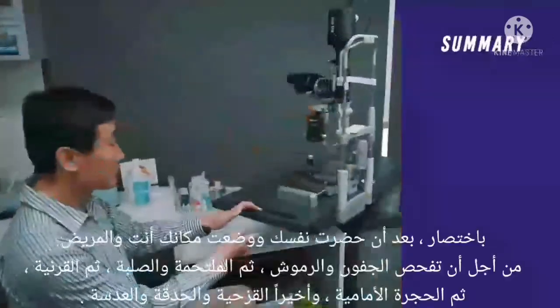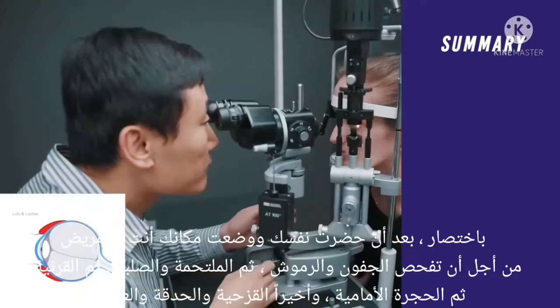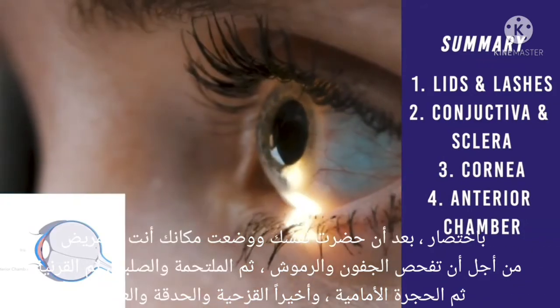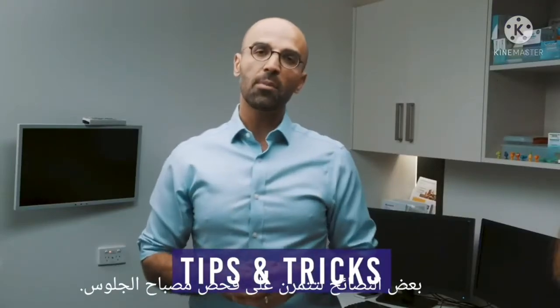So in summary, after you've prepared and positioned yourself and the patient, in order, you want to examine the lids and lashes, then the conjunctiva and sclera, then the cornea, followed by the anterior chamber, and finally the iris, pupil and lens. A couple of tips for practicing your slit lamp examination.